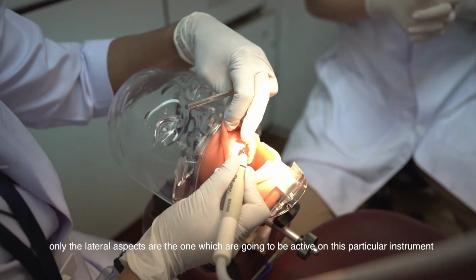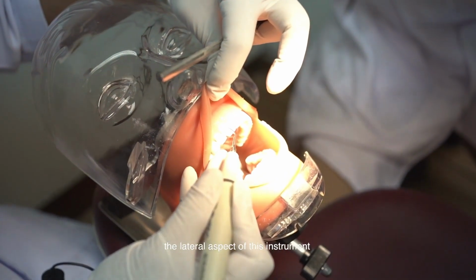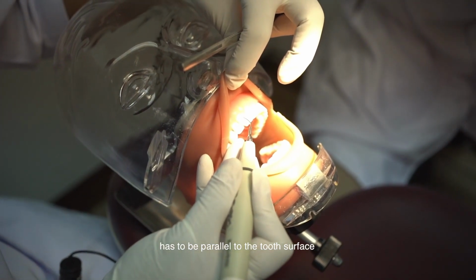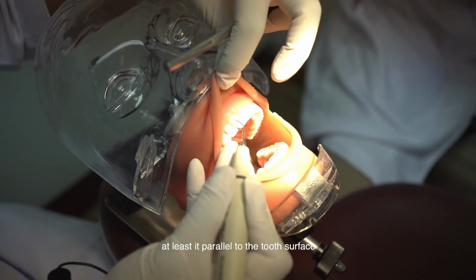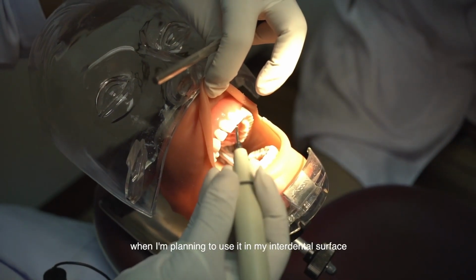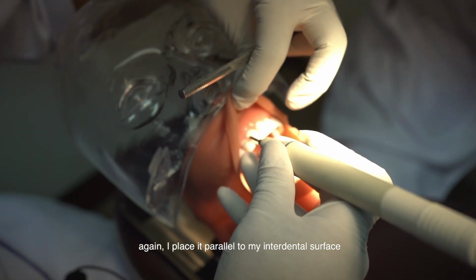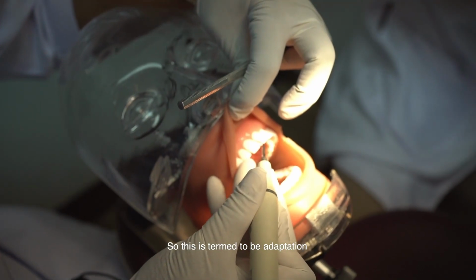As I told you, only the lateral aspects are the ones which are going to be active in this particular instrument. The lateral aspect of this instrument has to be parallel to the tooth surface wherever possible. For example, when I am going to use my labial surface, I place it parallel to the tooth surface. When I am planning to use it on my interdental surface, again I place it parallel to my interdental surface. Got it? With a horizontal stroke. So this is termed adaptation.